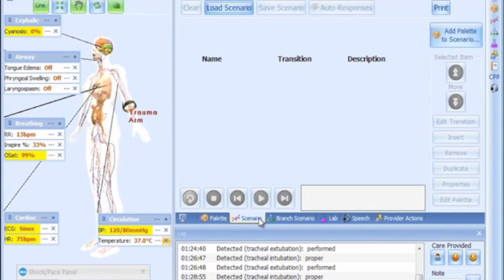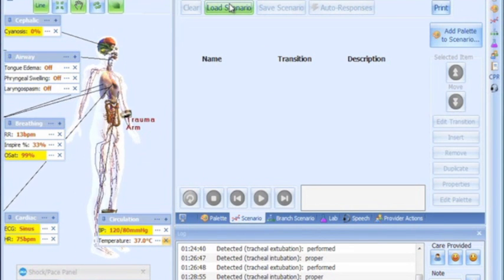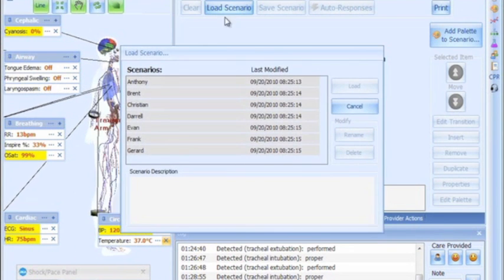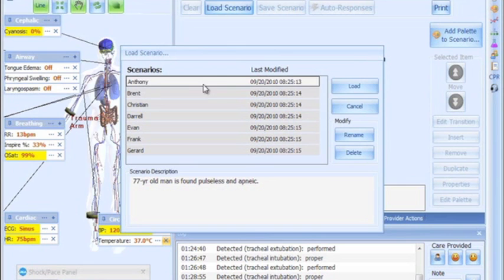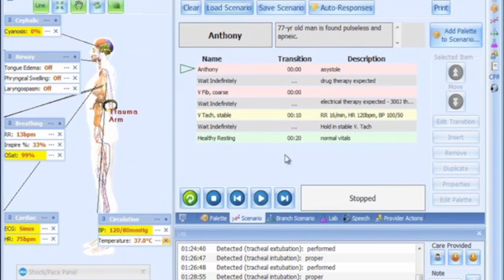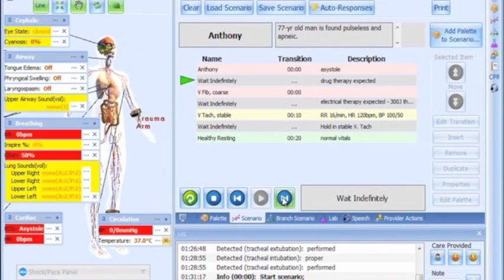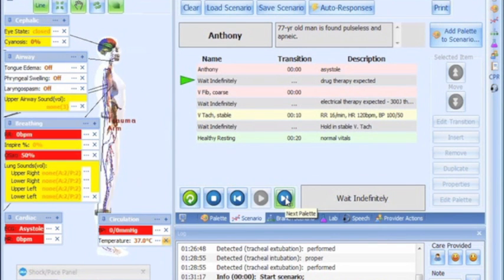For simulations to be most realistic, it is beneficial to use scenario-based training sessions. For your convenience, the software comes preloaded with several scenarios to get you started.